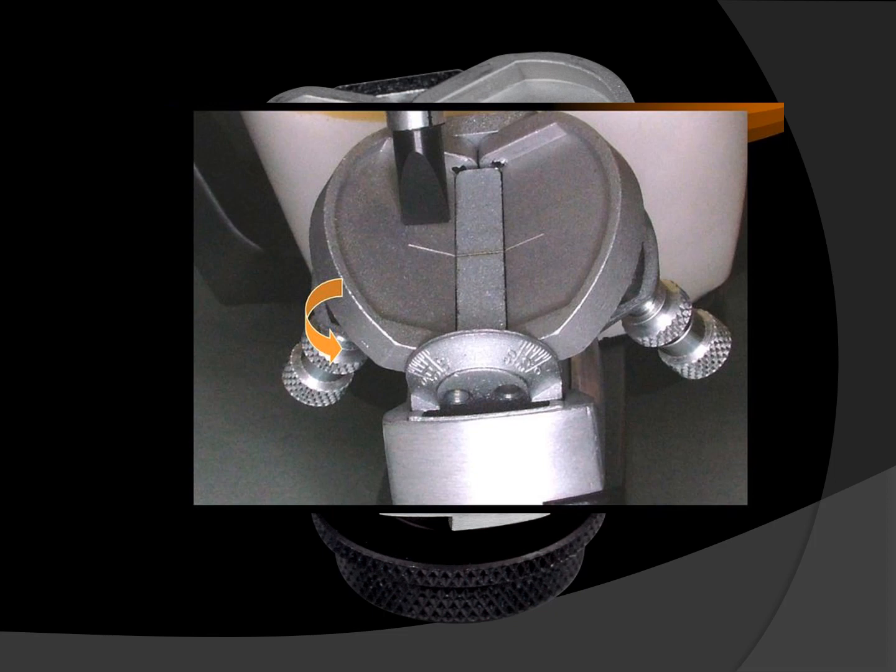Now the patient is asked to move his mandible to the right, that is, to reach an edge-to-edge canine relationship till there is disocclusion elsewhere, and then this position is noted. Then again the occlusal rims are transferred to the articulator, the same movement is carried out, and during lateral disocclusion the incisal pin will rise from the table, and then the lateral wing is adjusted. Okay, it is lifted up until it touches the incisal pin. So this procedure is again repeated for the contralateral side. So this is the procedure for setting the incisal guidance.